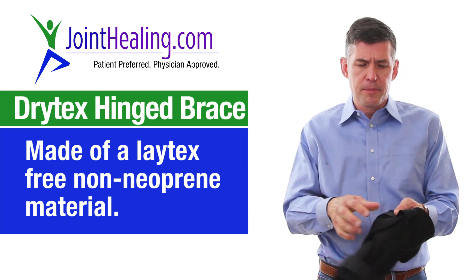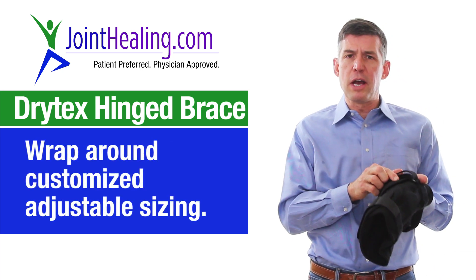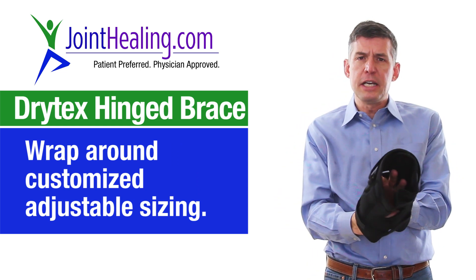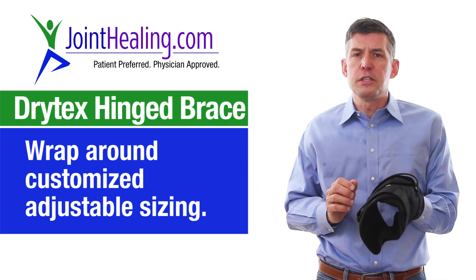It's also a little bit stretchy. We have this special wraparound design that allows you to contour and custom fit your knee. No matter how thick or how thin your knee is, you can fit it into this brace.